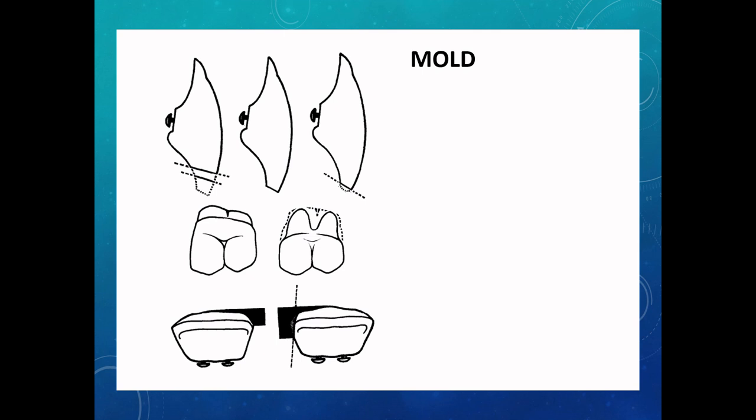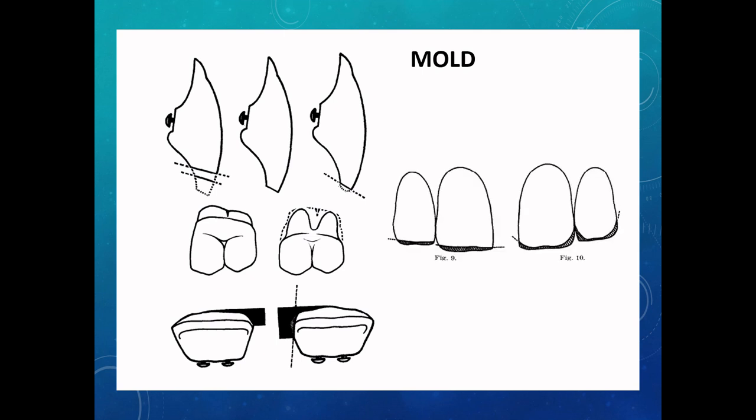We know that a delicate mold is feminine and a vigorous mold is masculine. So a medium pleasing personality mold is made more masculine by squaring of the incisal edges, whereas it is made more feminine by simply rounding of the incisal edges, which we have already discussed in our previous slides.